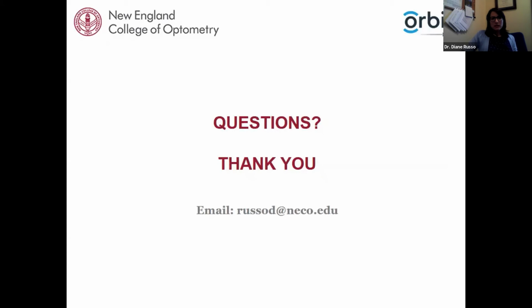Which is the best in refining sphere between the duochrome test and binocular balance? So I'm not entirely sure what this is asking. Is it asking if you would use duochrome for binocular balance or not? My personal preference throughout years of practice is I know that the duochrome test exists.